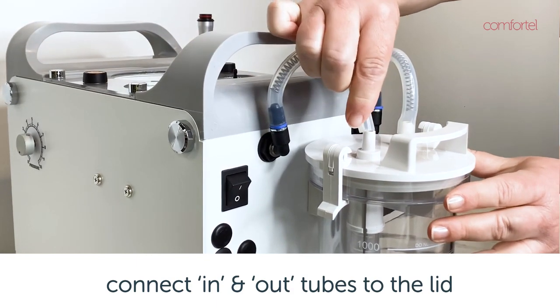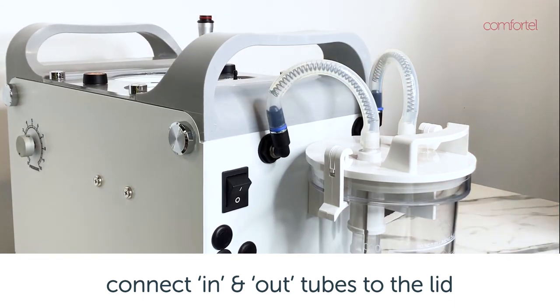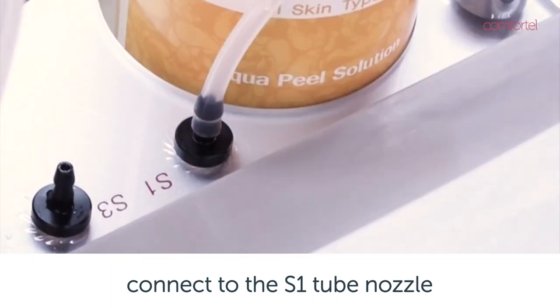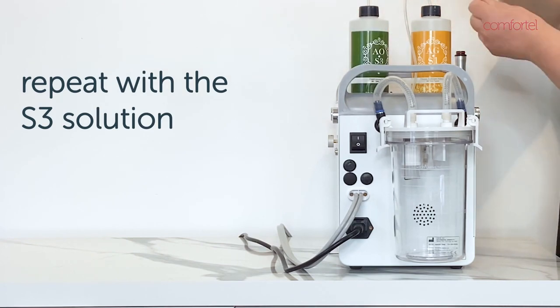Connect the in and out suction tubes to the bottle. Contents of the suction bottle should be cleaned out after every use with warm water and detergent. Place S1 into the machine slot and attach the tube to the S1 nozzle, attaching it firmly. Repeat this with the S3 bottle.